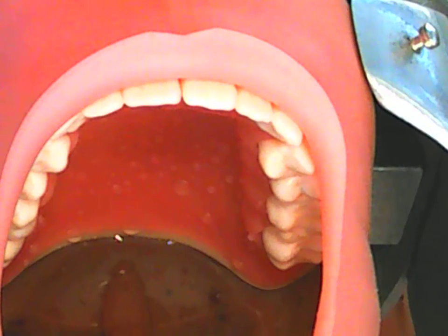Please note the extra distance I provided between the last punch and the key punch hole as well. We want to ensure full gingival coverage, and that's one way to do that. The dental dam is now punched. I'm going to go ahead.